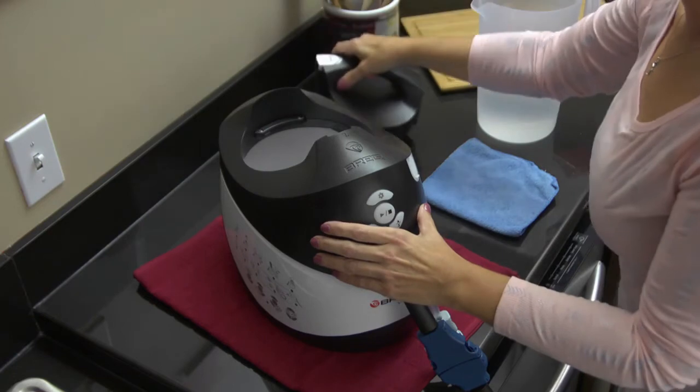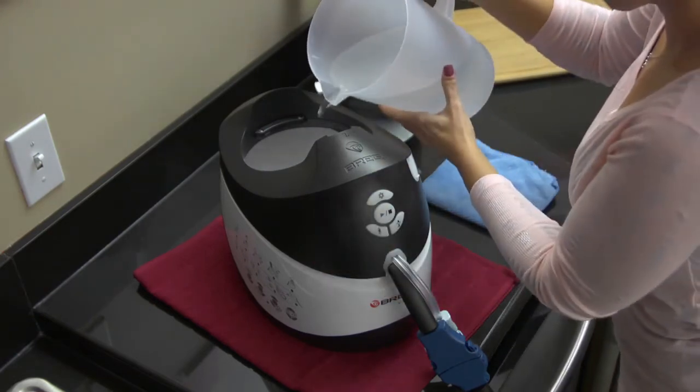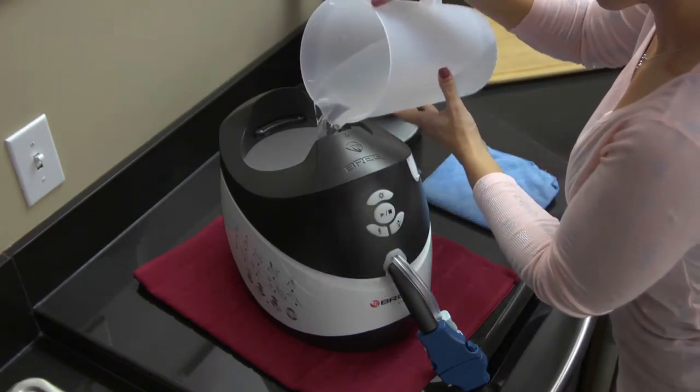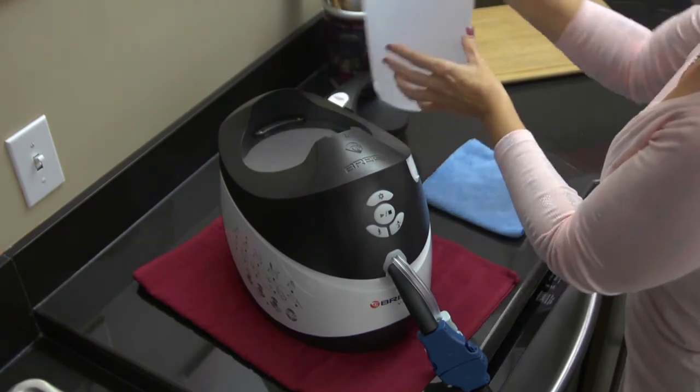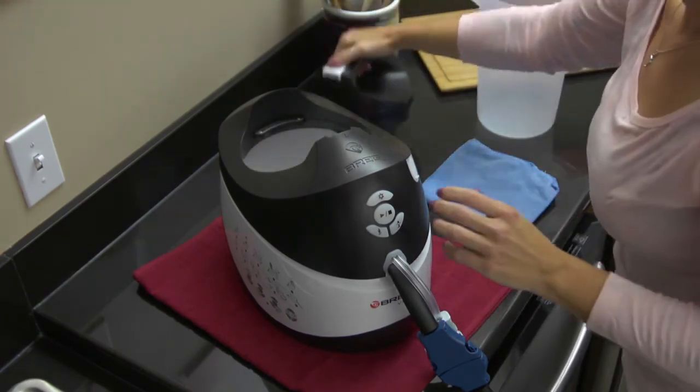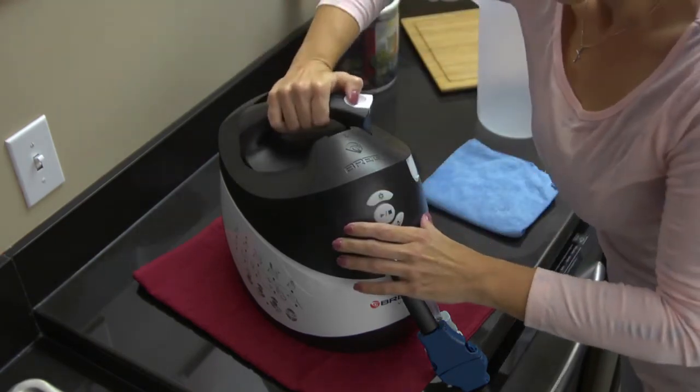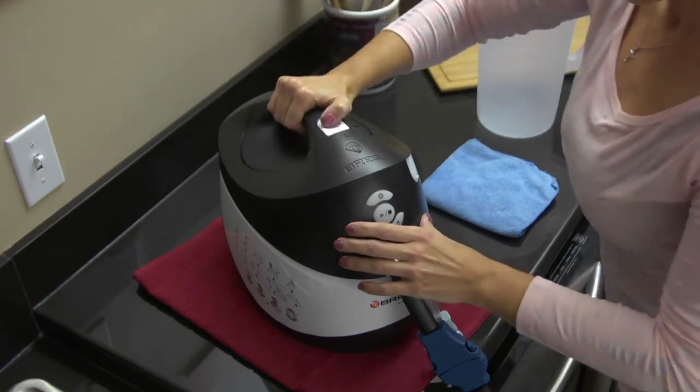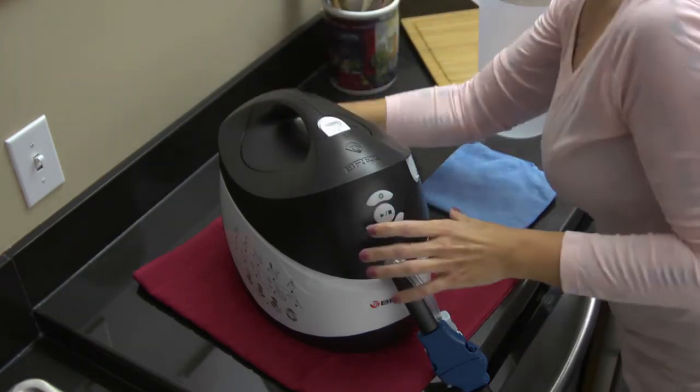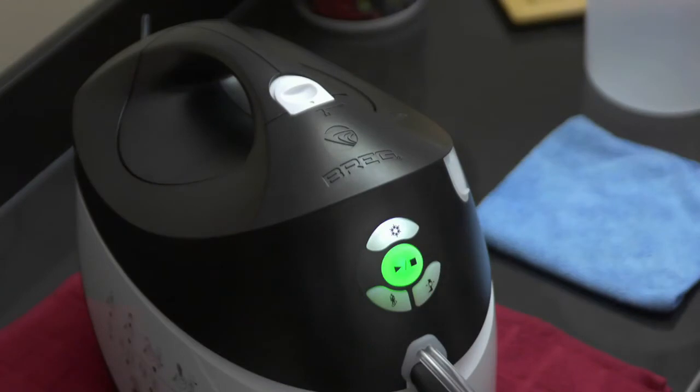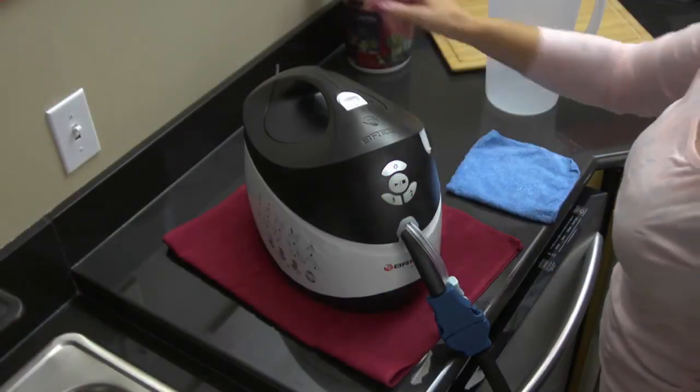Remove the electrical cord and fill the empty container to the max fill line with fresh, room temperature water. Do not use any cleaning solutions in the water reservoir as these solutions could damage the water pump and therapy pads. Replace the handle and connect power. Operate the system for 10 minutes and then empty the water reservoir.